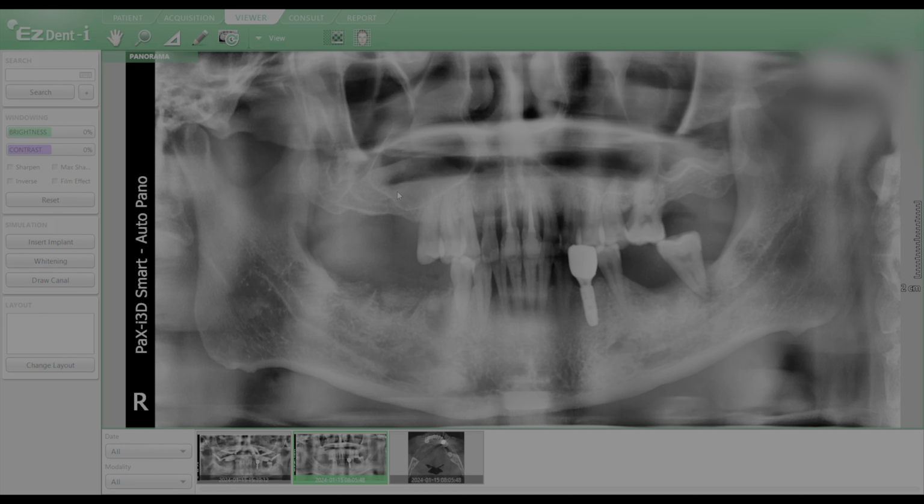Okay, so here we go. Again, similarly, just very large sinuses, and the problem is that they drift very far anterior. So whenever I'm placing my dental implants after I do all this bone reduction, I don't have that much space to be able to place his implants. So similarly with the other cases, what we did is, how many implants did I do on him? I did like 6 on him today. Yeah, 6 with bilateral sinus lifts.